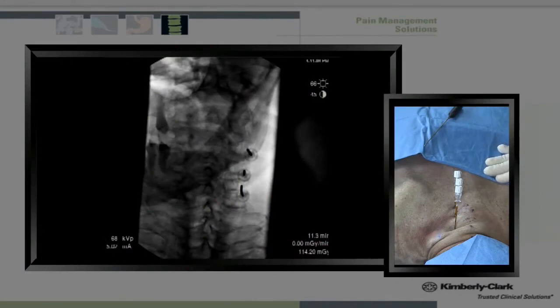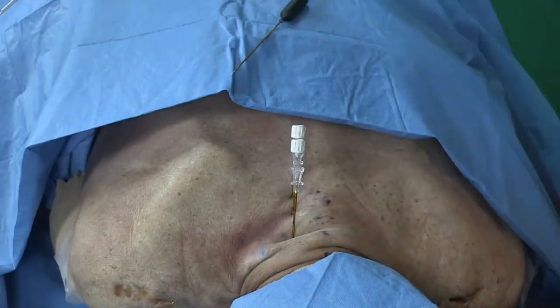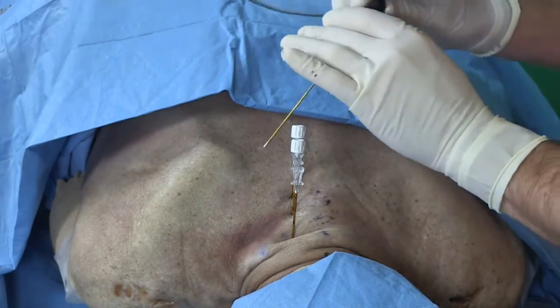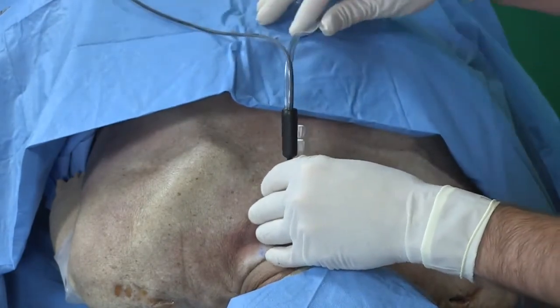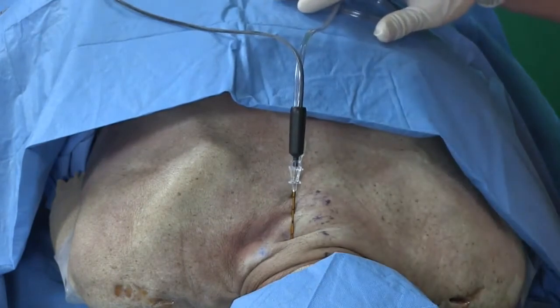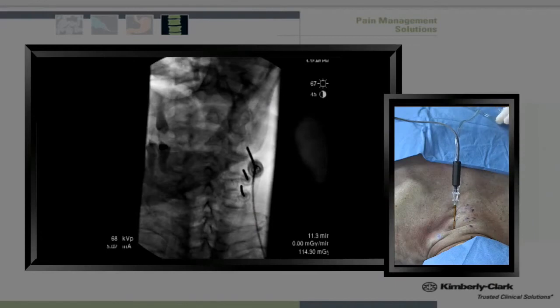Now that I have placed the three needles at the waist of C4, C5, and C6, I will go lateral to confirm placement. Now that we have confirmed proper placement on lateral perspective, I will do motor testing. I place the probe into the introducer, make sure that it fits snugly, and take another image just to confirm placement.